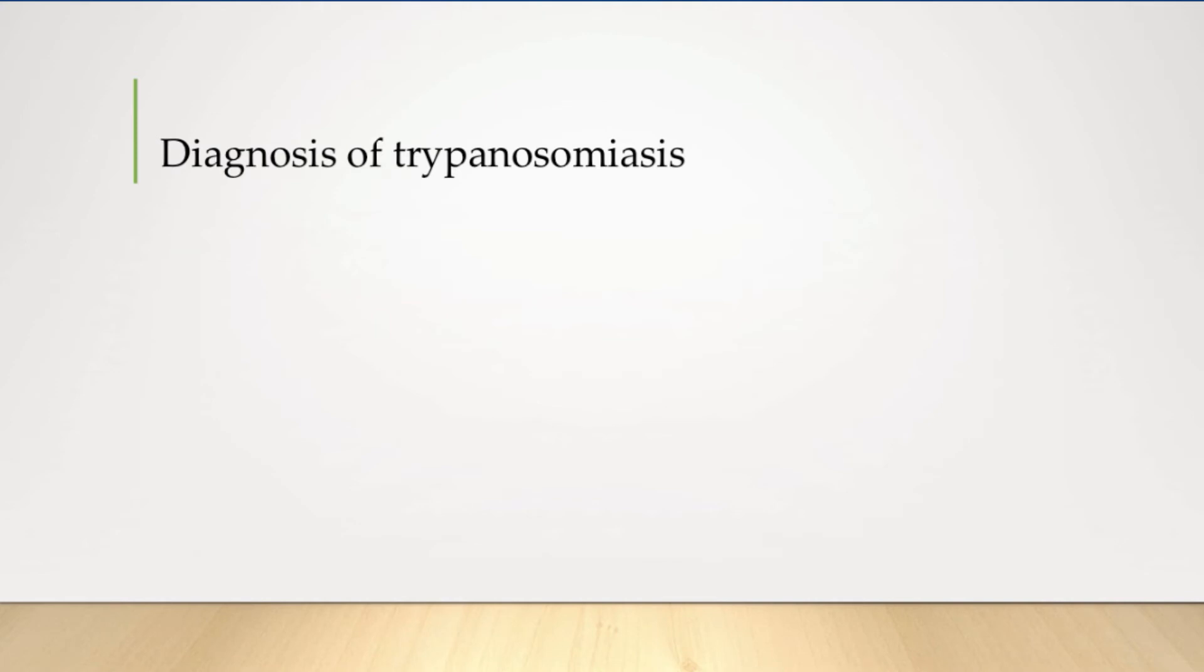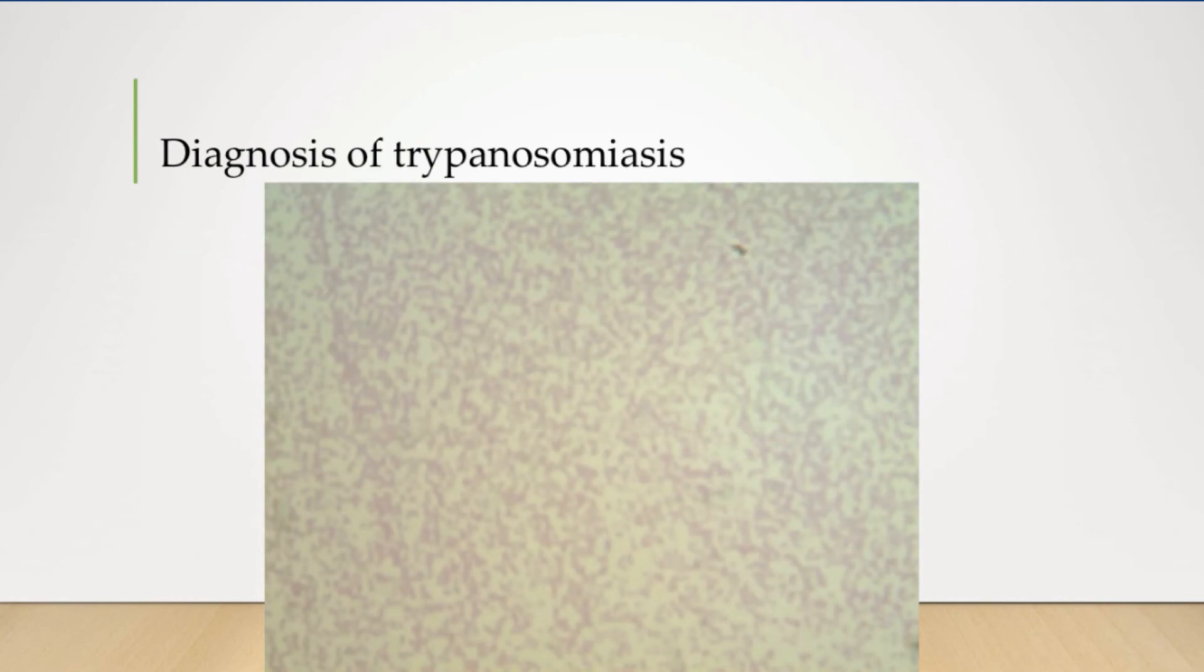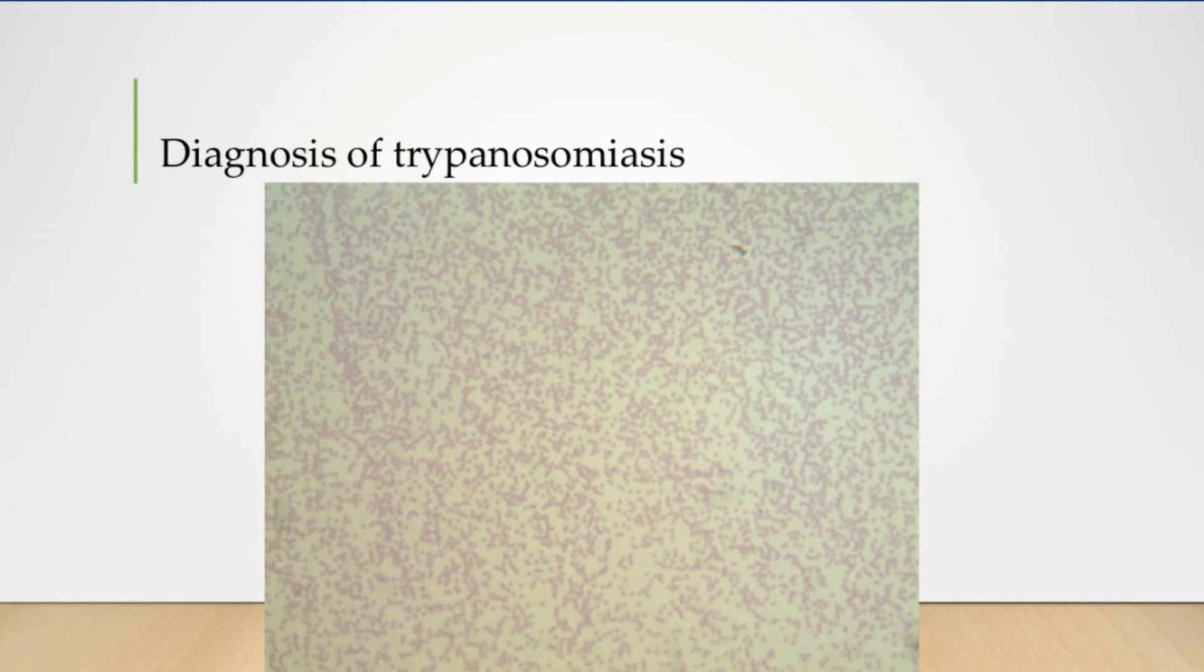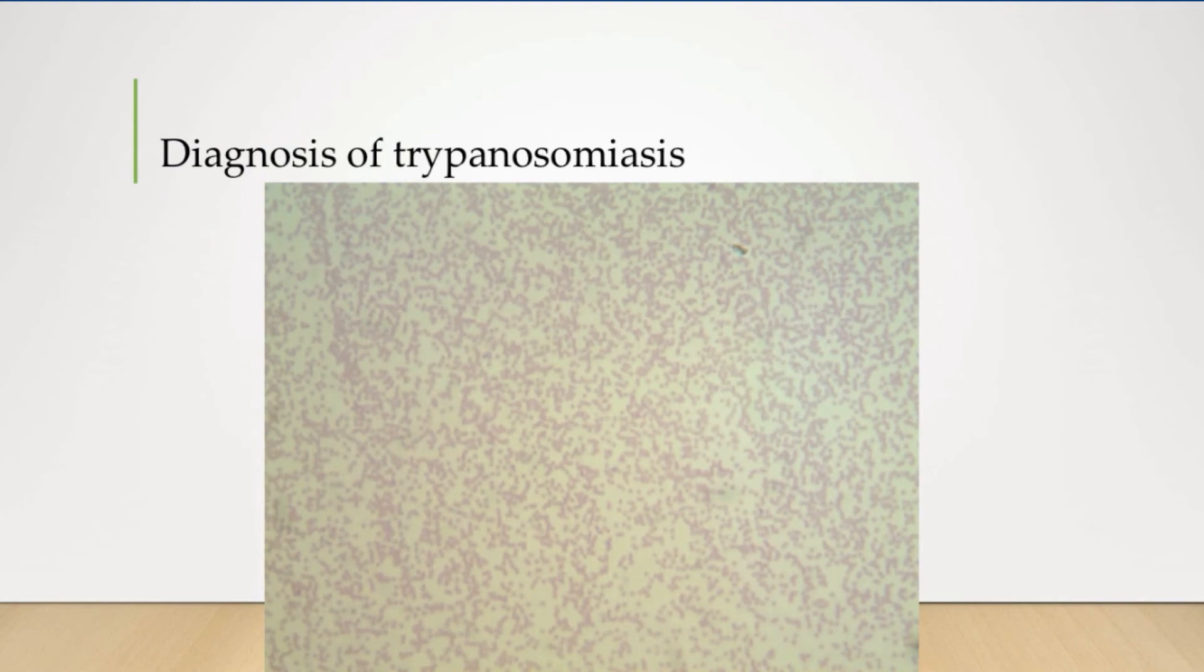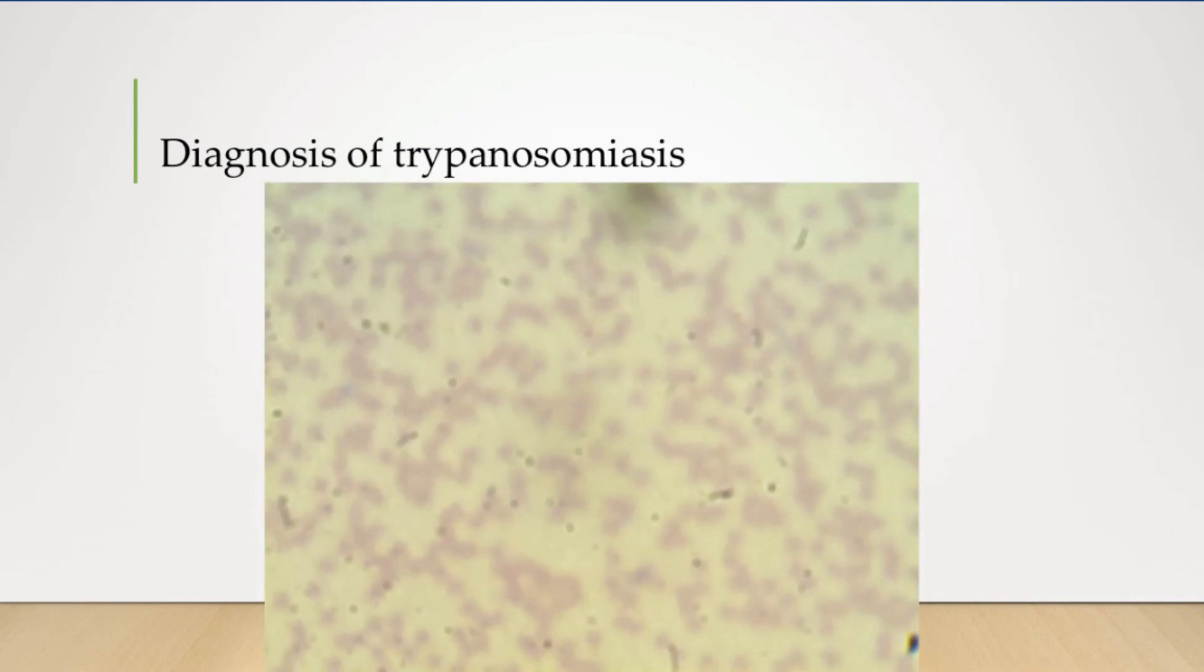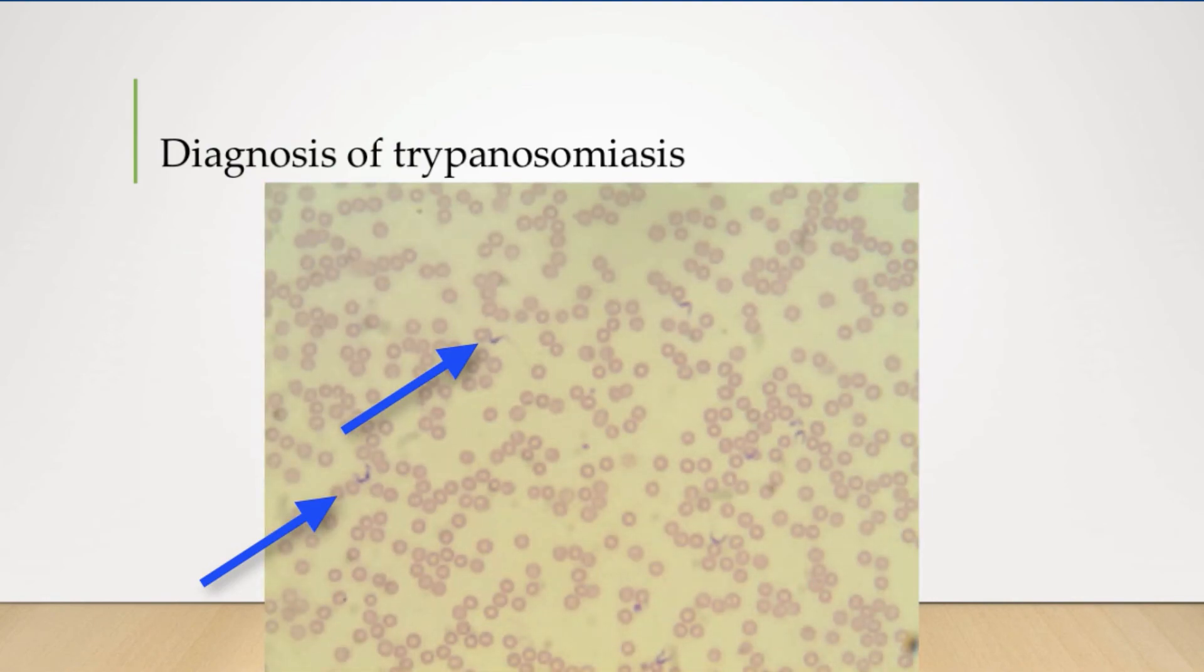Both African and American Trypanosomiasis are diagnosed by identifying the flagellated forms of the protozoan in a blood smear. Again, start at a 100-fold magnification, then increase the magnification to 400-fold. Identify the purple flagellated protozoan parasites in between the red blood cells.